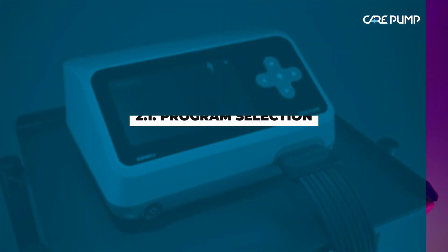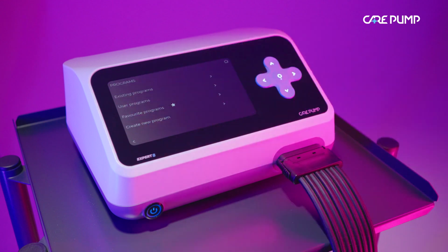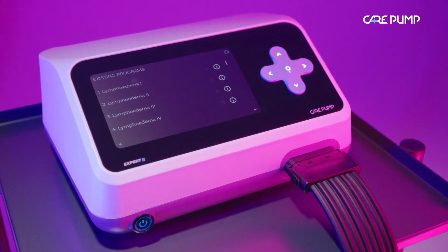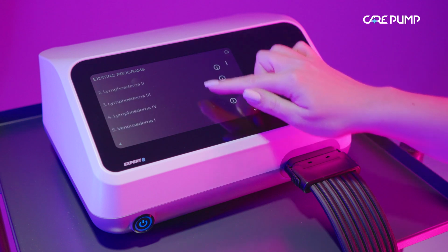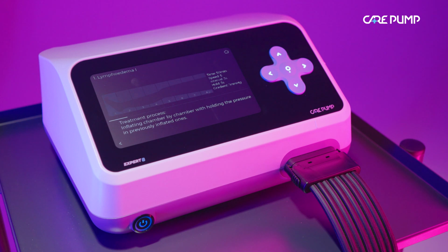Program selection. Press Program icon. On the screen, you will see the menu where you can choose a program from existing programs, user programs, favorite programs, or create a new program. Existing programs are a list of treatment protocols developed by Polish Linfológica Society with defined parameters such as sequence and speed of filling the chambers, treatment time, gradient, interval and hold function.